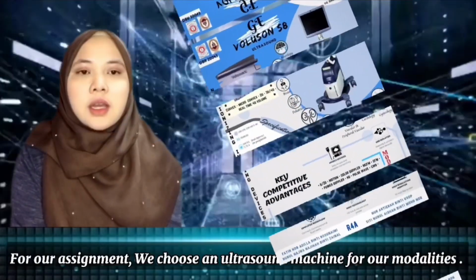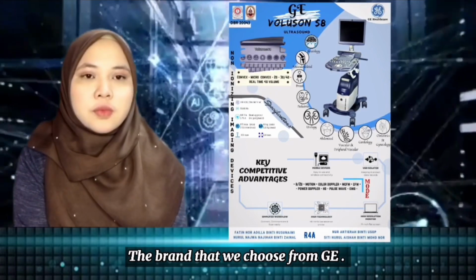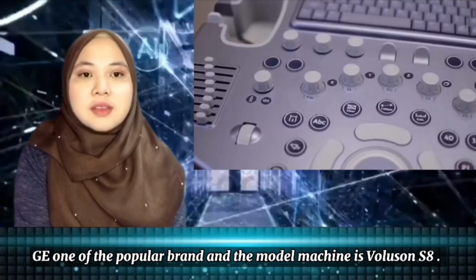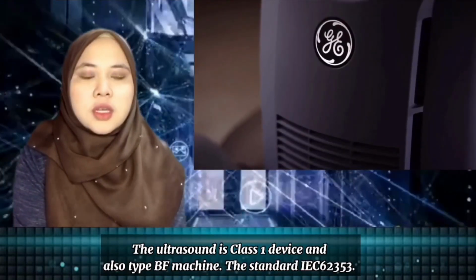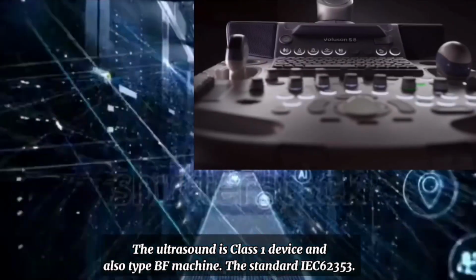For our assignment, we chose an ultrasound machine for our modalities. The brand that we chose is GE, one of the popular brands, and the model is the VOLUSON S8. The ultrasound is a Class I device and also a type BF machine. The standard is IEC 62353.